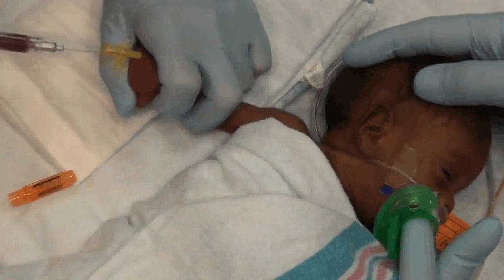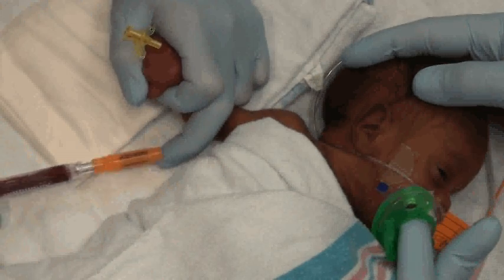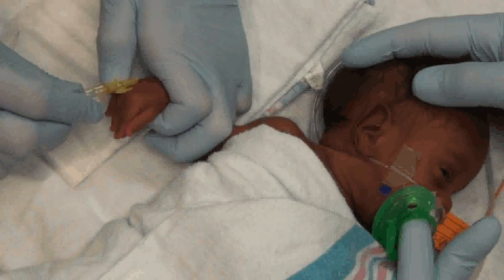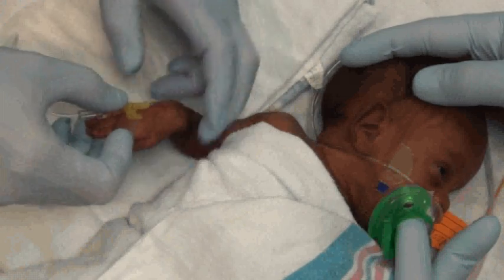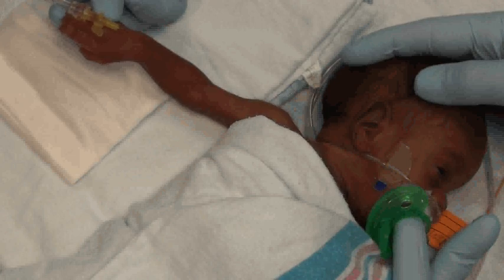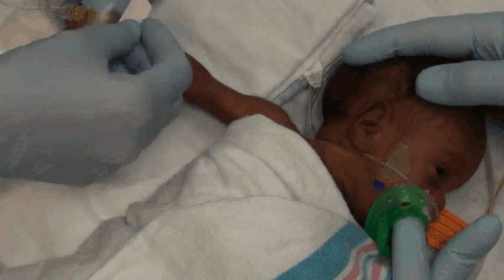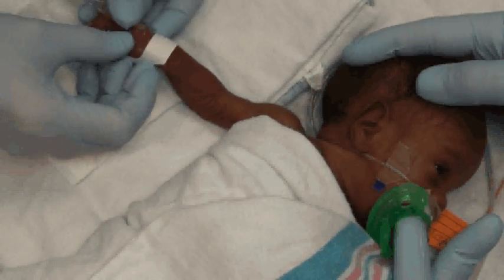When the desired volume of blood is collected, the catheter can be removed and pressure applied to tamponade the site. If intravenous access is required for the administration of intravenous fluid, medications, or the infusion of blood products, a 3ml syringe with primed extension tubing and a clave can be connected to the back of the angiocatheter. The site is then dressed and secured in the standard fashion.